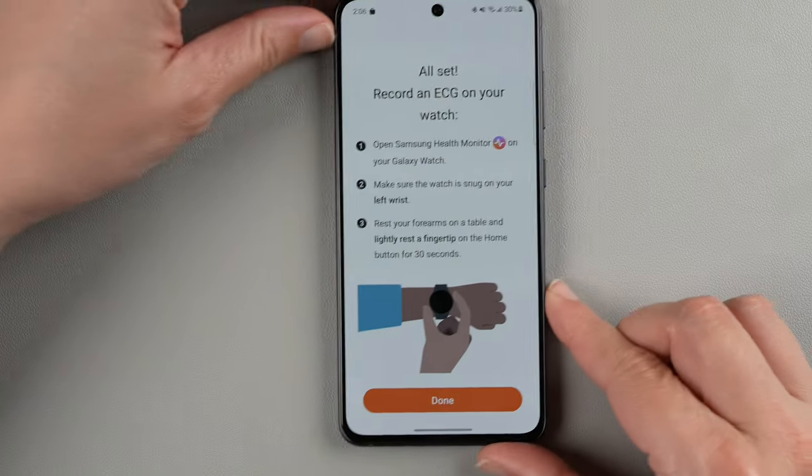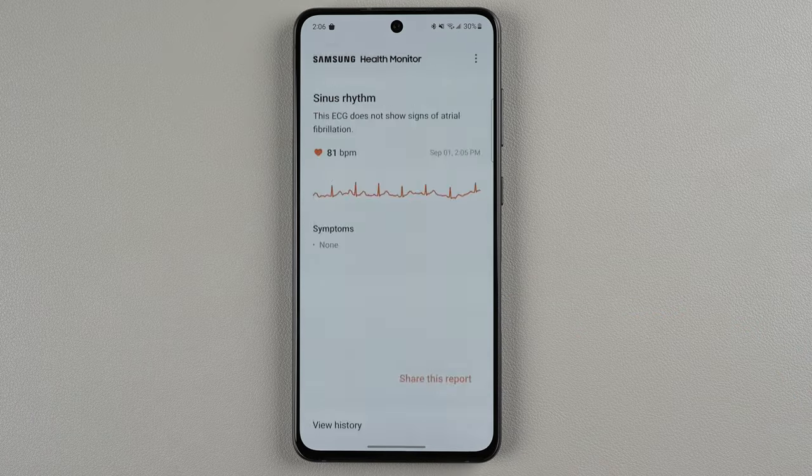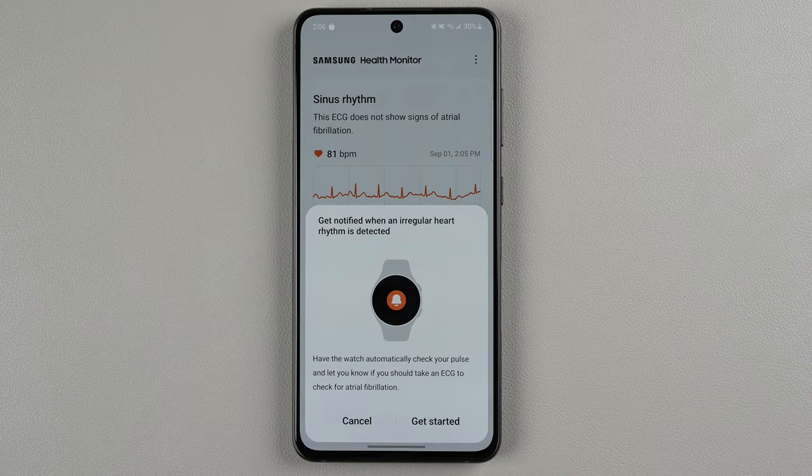Let's see what happened now on the phone. I'll go ahead and tap done. Now that I've taken that one ECG, it says that I can set up the irregular heart rhythm notifications.